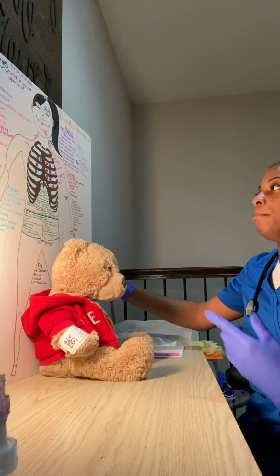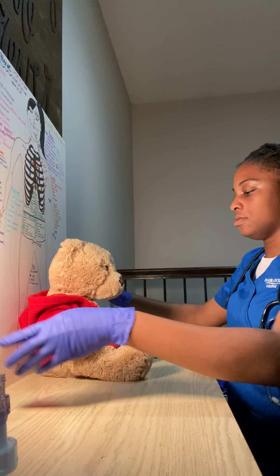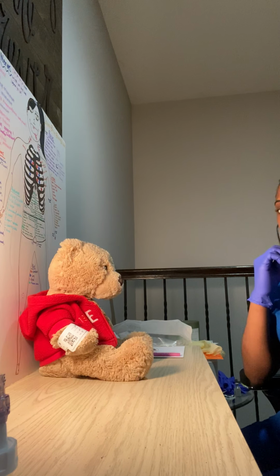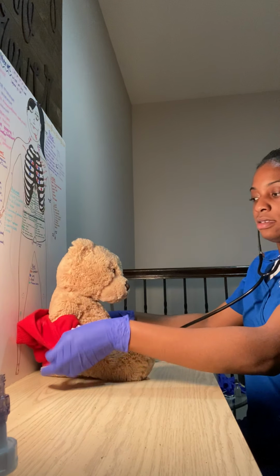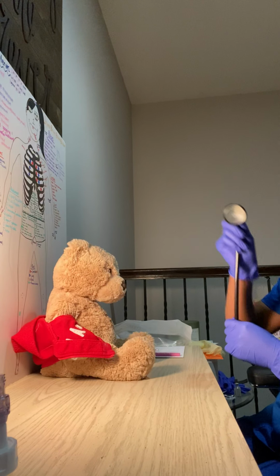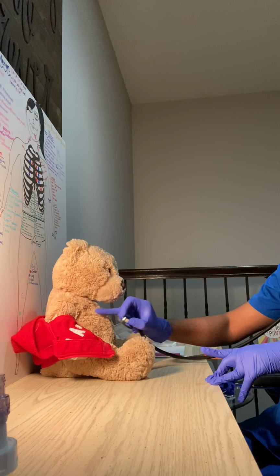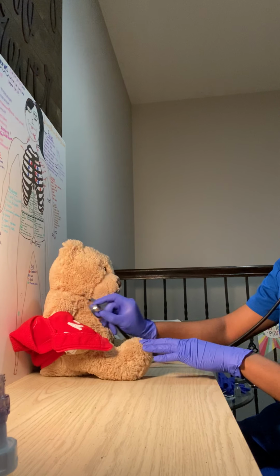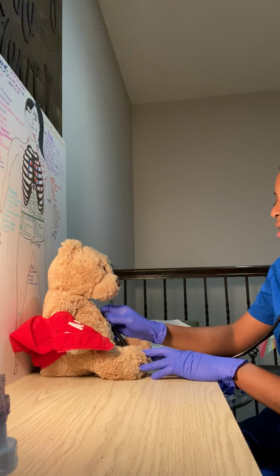I've also got my board here so that I can show exactly where I'm going to be auscultating and listening to the lung sounds. Again, as I'm moving down, I'm going to be assessing his skin. I'm going to take this down so you can see a little better. When I'm listening to lung sounds, I go from left to right, then down, then back. I'm going to start here. His lung sounds are normal.